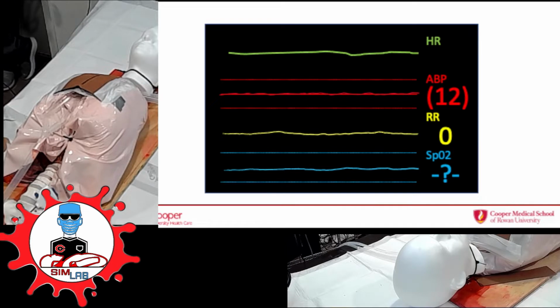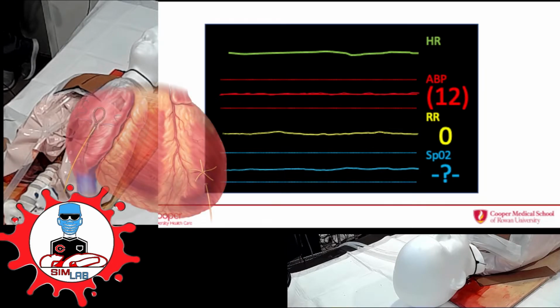And he has a pacer? He has epicardial wires, correct. How do you know? He has a pacer box connected to him with the epicardial wire here. Point to the guys at home. Yeah. And are those V or A wires? I don't know. Okay. Anybody know? So it's both. It's orange and white. Orange and white, okay.